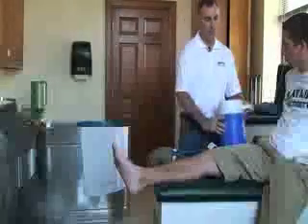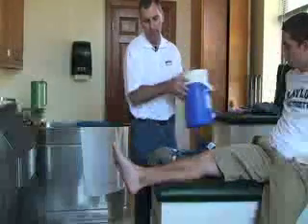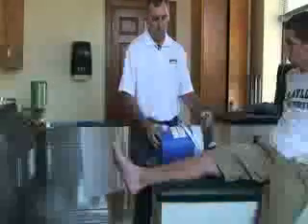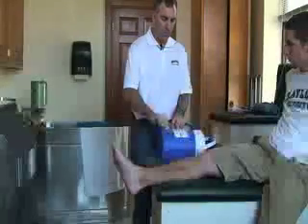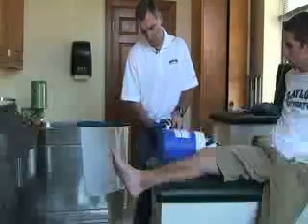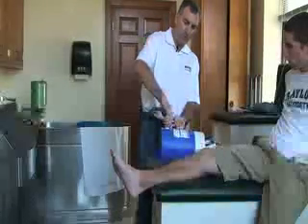Next, we make sure the lid is on tight. Then we make sure all the vents are closed. Next, we tilt the bucket on its side and unscrew the fitting. Then we screw the tube attachment to the bucket, making sure it is secure so that it doesn't leak.